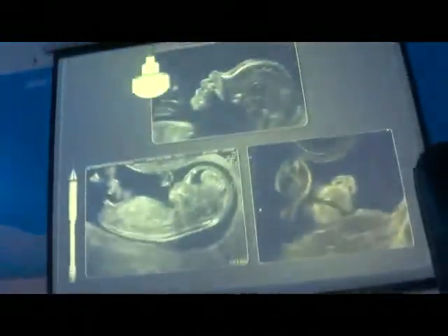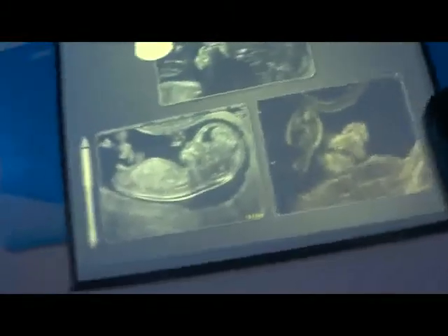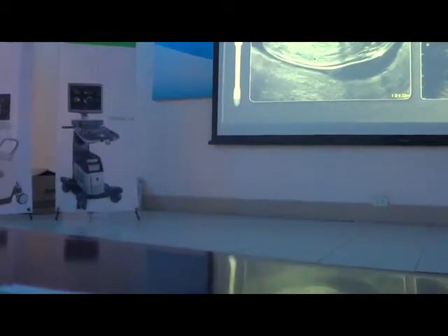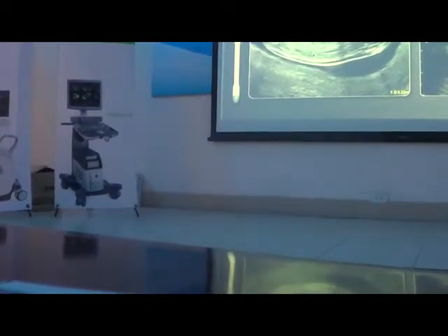But in the first trimester of the pregnancy, we can use a transvaginal probe, especially because we obtain more precise picture. Tuy nhiên ở trong quý 1 thì đầu dò đường âm đạo bổ sung rất nhiều tính năng hiệu quả trong siêu âm thai quý 1.